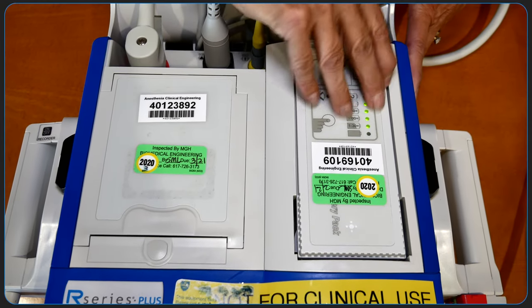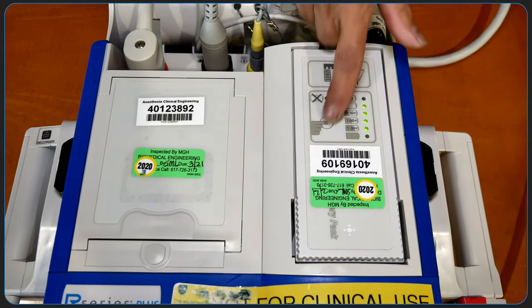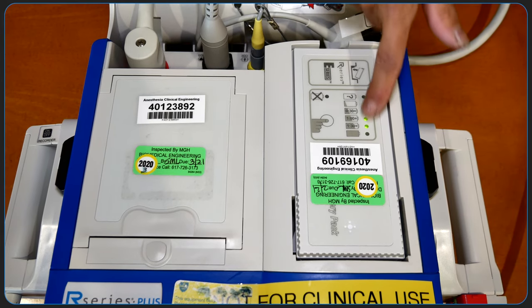The replaceable battery pack is located on the top of the unit. Remaining charge on the battery is shown by pushing the button as demonstrated here.